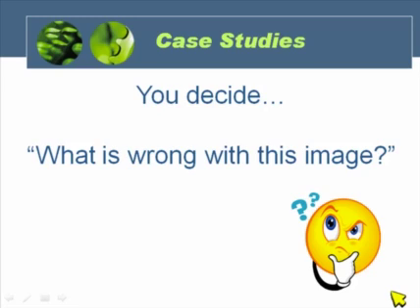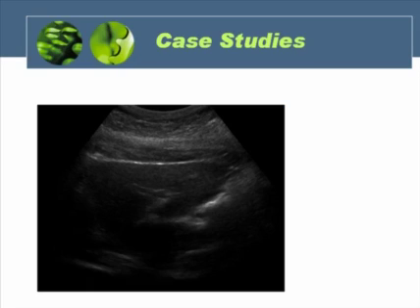Let's look at some case studies, and you decide what is wrong with this image. Evaluate this image. Tell me, what do you think is wrong with it? Correct. The image is underpenetrated. We're not seeing this far field well at all.